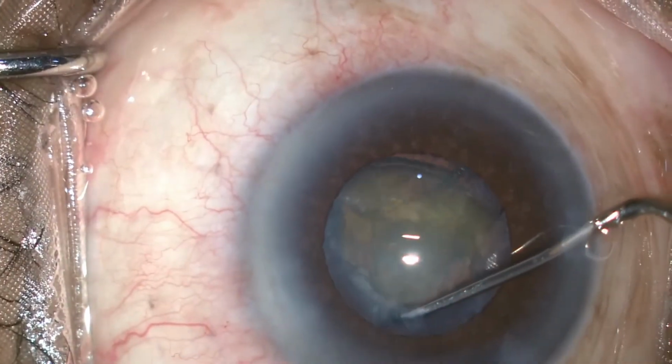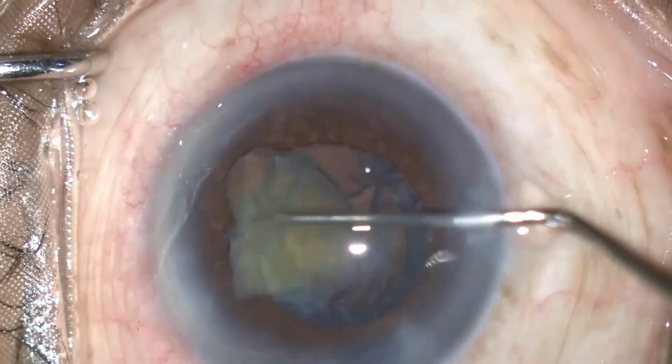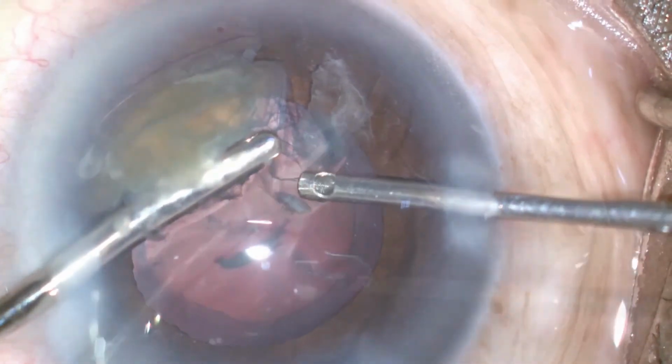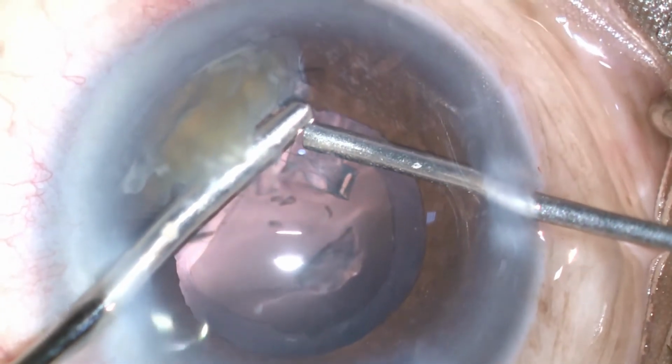And with careful maneuvering, the last lens fragment is got into the anterior chamber. Now anterior vitrectomy is done, protecting the nucleus, and you can see while doing vitrectomy also the rent appears so stable with a controlled infusion.